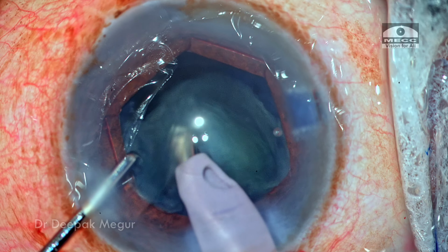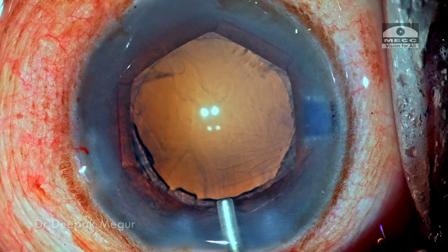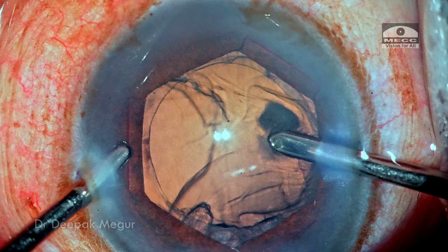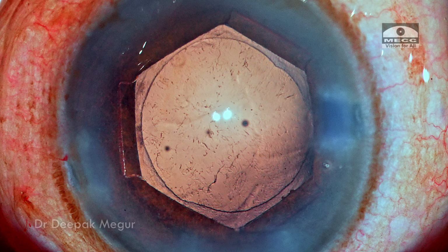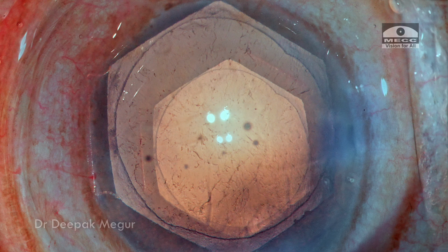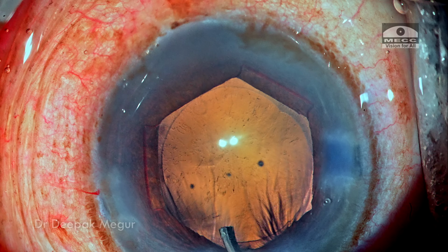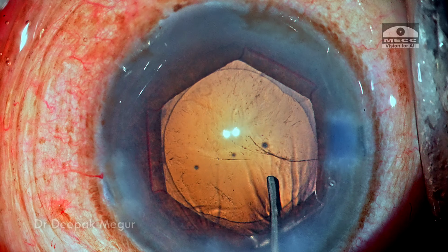Now is the time to aspirate the cortex. So the bimanual I&A is used to aspirate all the cortex. Now I just want to pause here and show you the fine fibrils which are there on the posterior capsule. And I would want to spend a few seconds here using BSS to just blow them away.